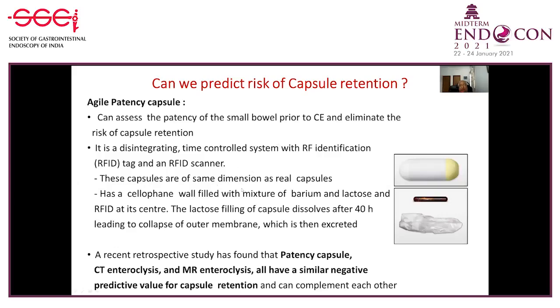The risk factors for this complication include old age. Most patients expectorate the capsule out, but occasionally it is aspirated. In cases with a high risk, it is better to directly place the capsule into the stomach in these patients.